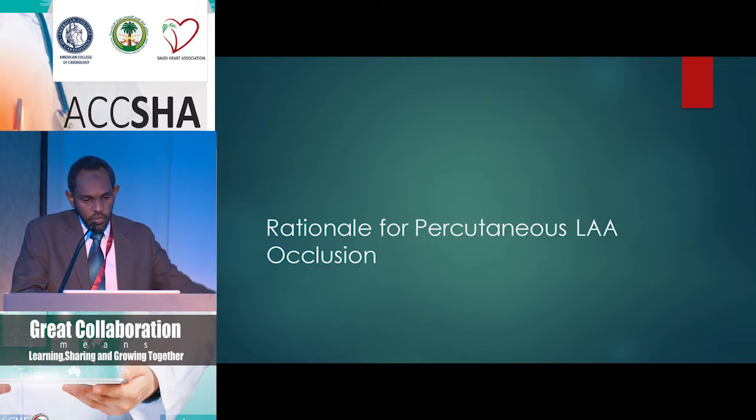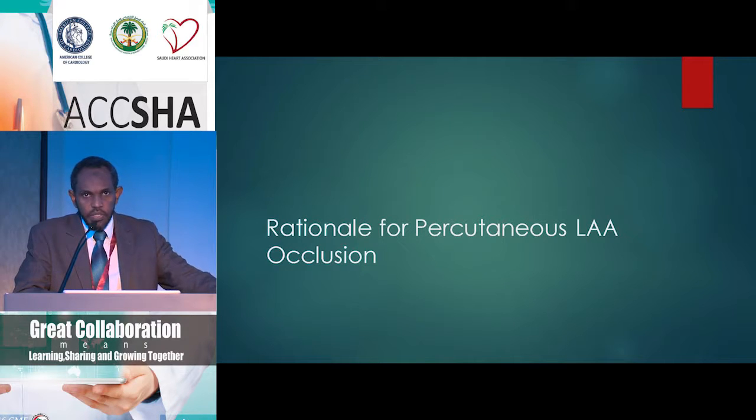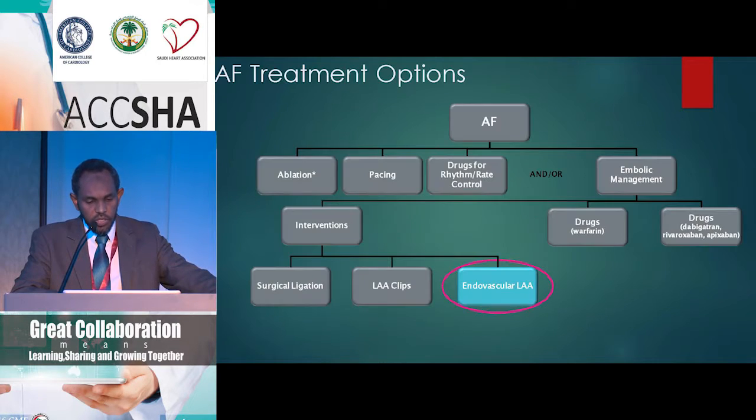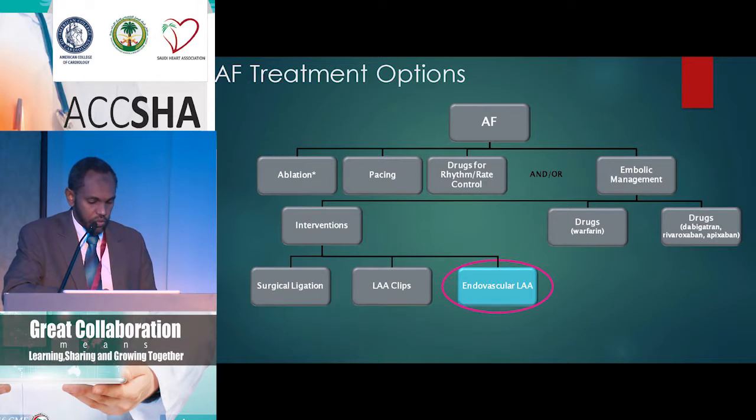So regarding the rationale for using LAA occluders, as you all know, the use of LAA occluders has become more frequent in the last few years, and it really has a little niche in the world of interventional cardiology and the management of atrial fibrillation, thromboembolic risk protection. Most patients still will receive oral anticoagulant drugs. And then there's a few patients that will receive LAA clips if they go to surgery, and then surgical ligation, and there's some LAA clips being produced commercially for use. We'll talk a little bit about one of the devices, but most of the current devices used are really endovascular LAA occlusion devices.